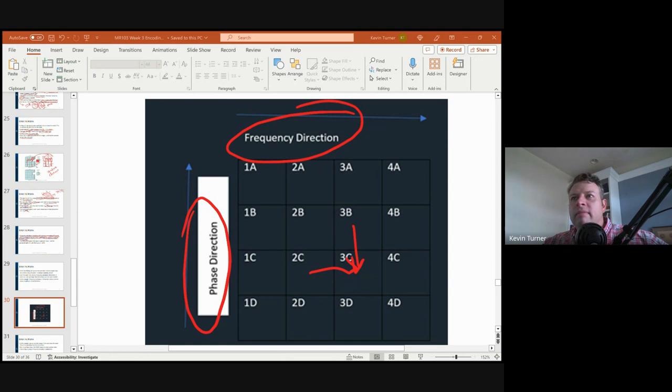What do you do? You get a patient who doesn't fit within the shoulder coil. You've got to go grab a different coil. Got to change your parameters. Can you do that? If you can't, then you are what we call a button pusher. You're like, I don't know how to do this. If you can, then you're a skilled tech. So you have to learn what all these things are so that when a wrench comes along and messes up your scanning, you know how to change it, right?